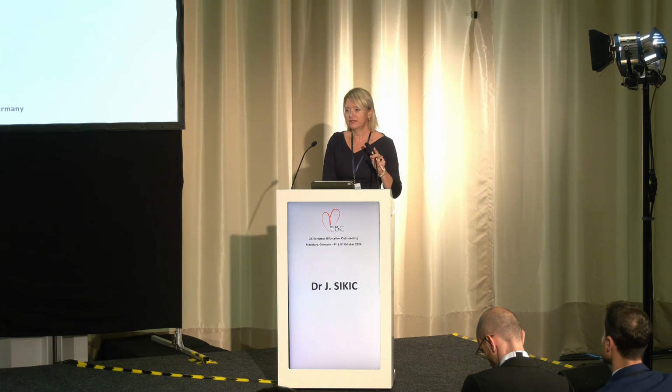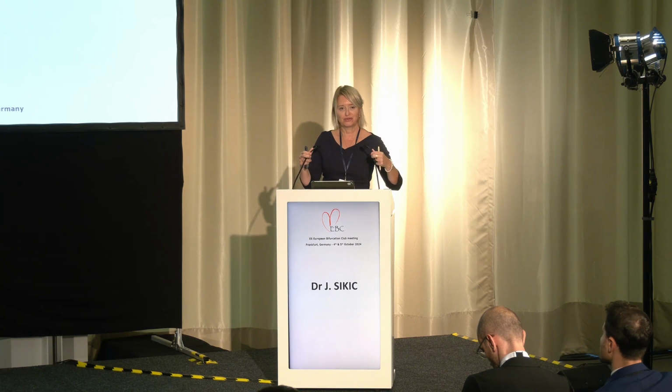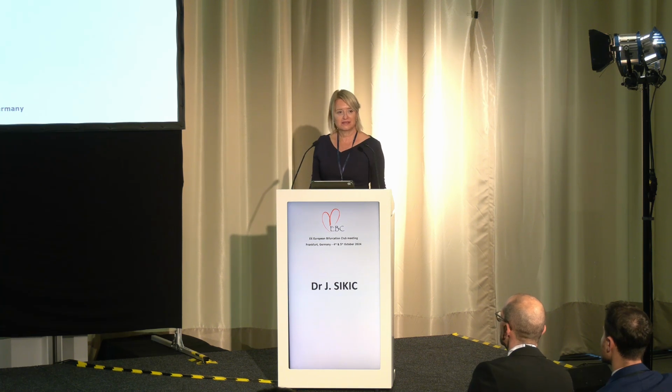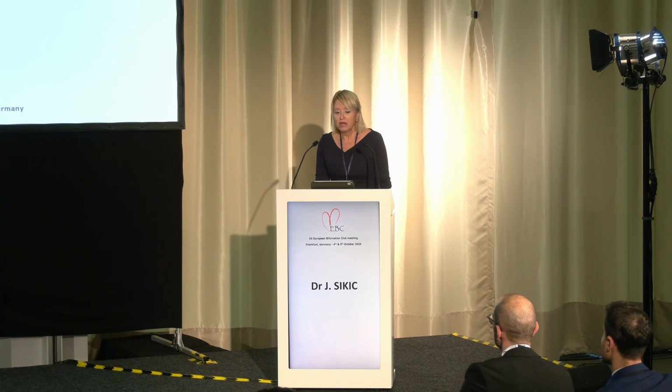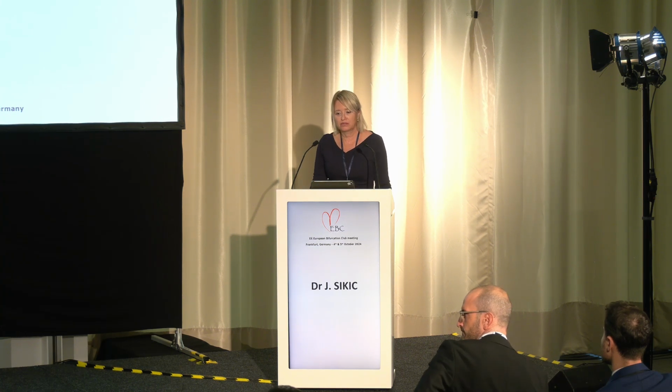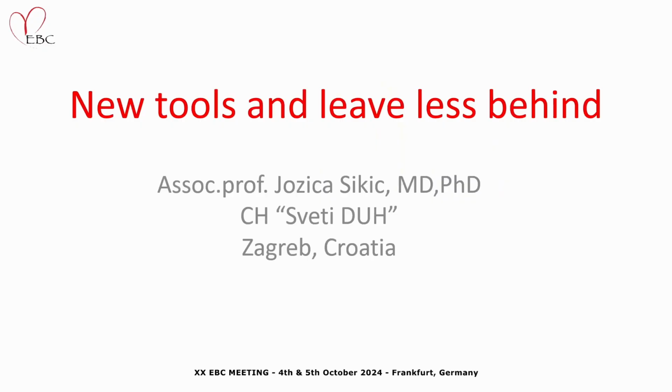All right, so ladies and gentlemen, dear colleagues, it is my pleasure to be again here with you, and also my honor to open this EBC 2024. So my talk will be about some new tools and how to leave as little as possible behind.